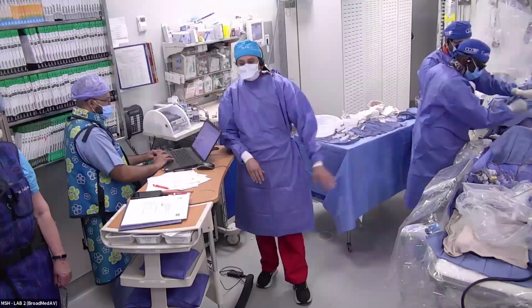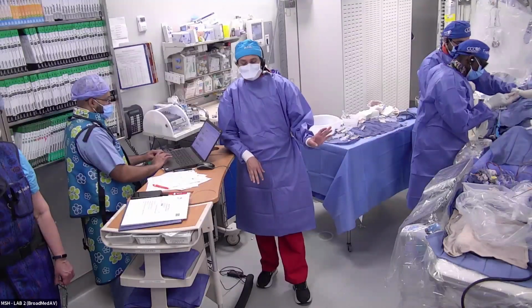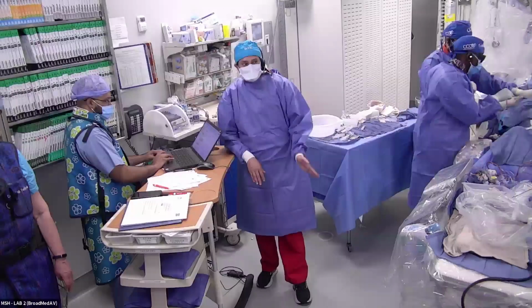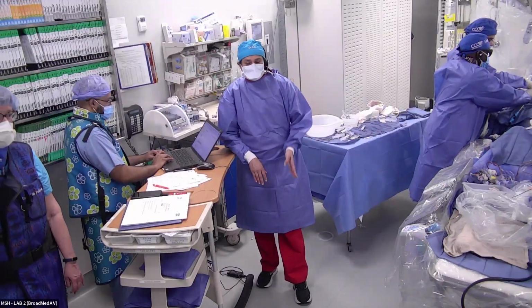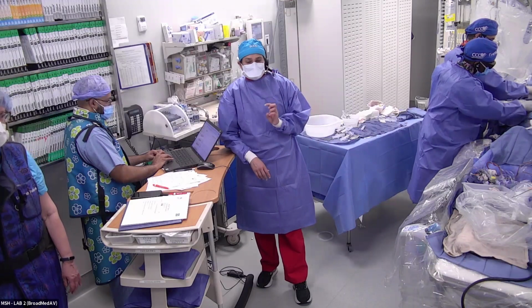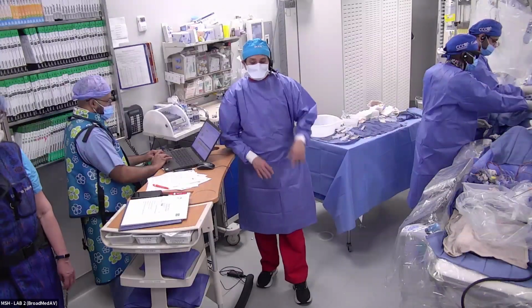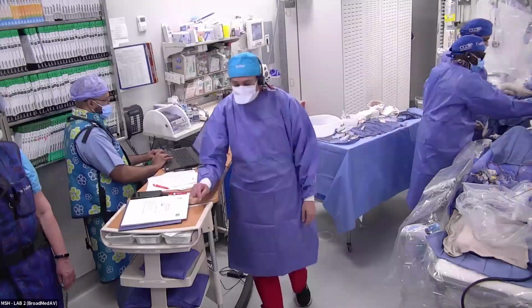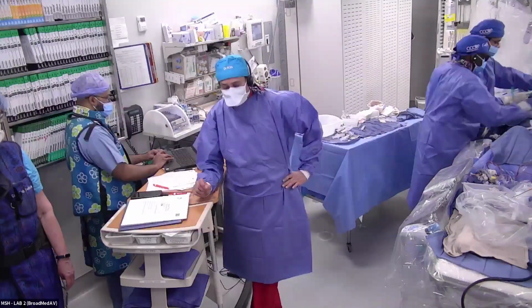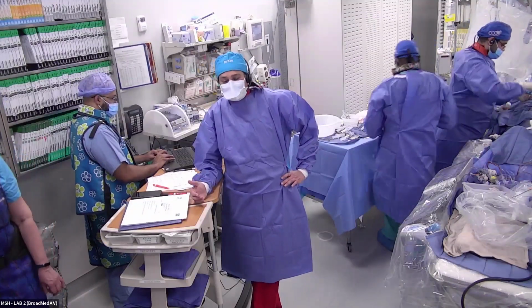Other than that, I know we did the drug-coated balloon so that we don't have to go back. But this is a kind of a side branch, the typical look of a balloon, cutting balloon or a balloon angioplasty, and you've done a provisional stenting. All the steps of rotational atherectomy and orbital atherectomy have been discussed in the calcific. So it's simple, all the techniques are nicely outlined, and it's a fast read.